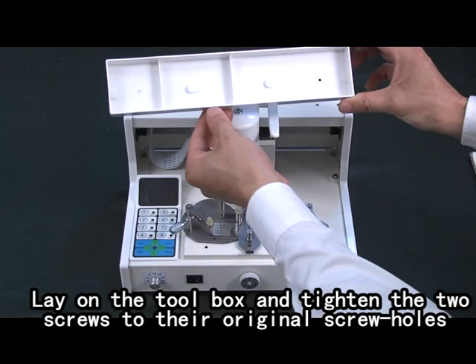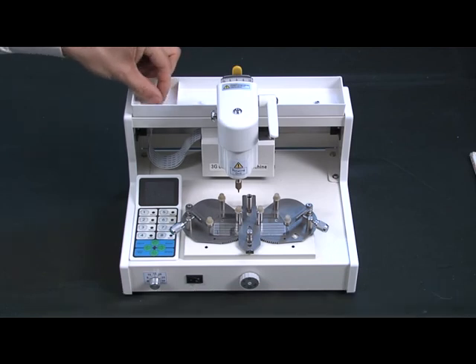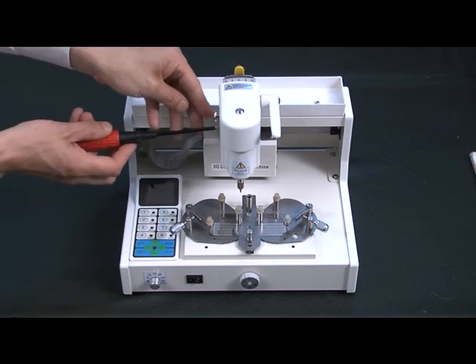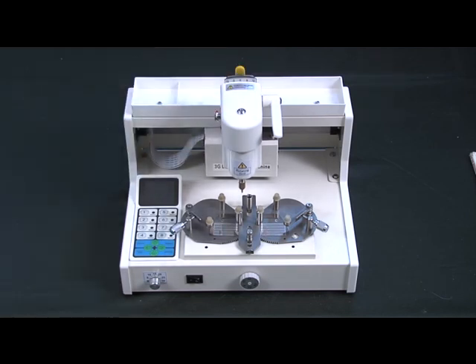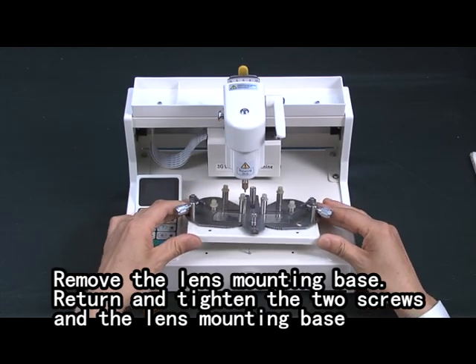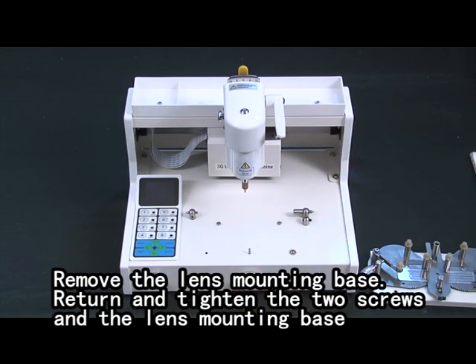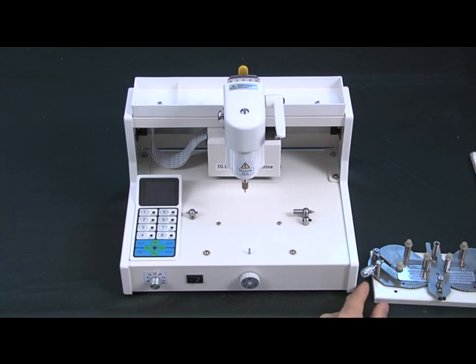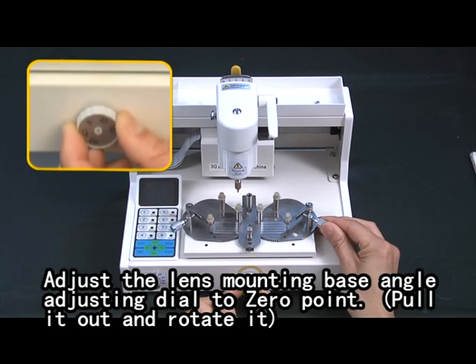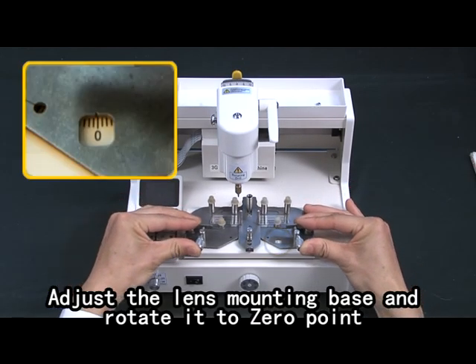Lay on the toolbox and tighten the two screws to the original screw holes. Remove the lens mounting base. Return and tighten the two screws and the lens mounting base. Adjust the lens mounting base angle, adjusting to zero point. Adjust the lens mounting base and rotate to zero point.